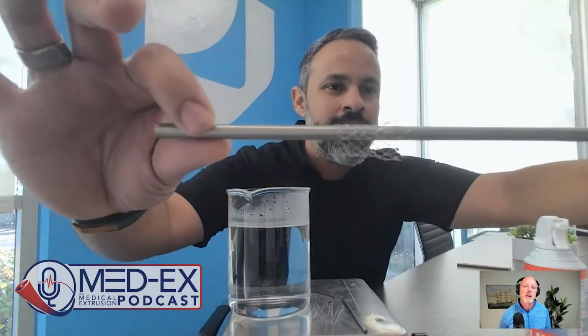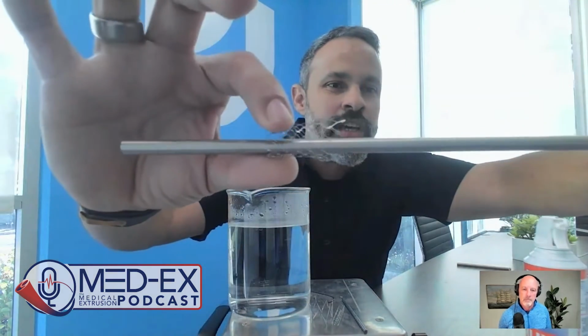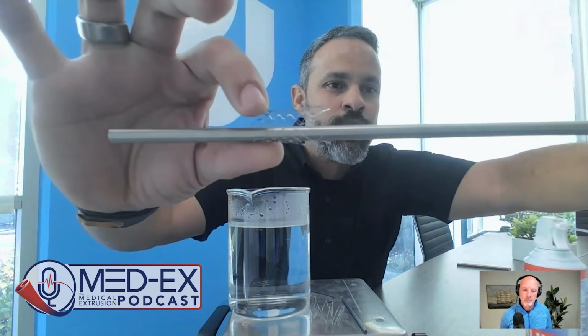Okay. Quick question on adding features to nitinol components, wires, hypotubes. Is it possible to add features? For instance, can you centerless grind the distal end to add some flexibility? Can you flare or flange the proximal end for maybe a connector of some sort? Yes, with Nitinol, definitely the sky's the limit. Again, I'm going to bring the same example. This is the tube that this ball frame was cut from. So you can see how, on the end shape, we have all these tapers and, you name it.